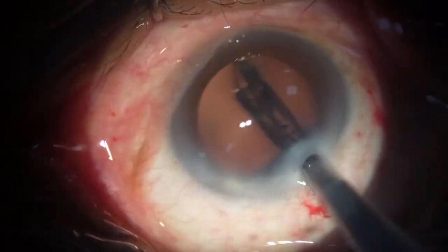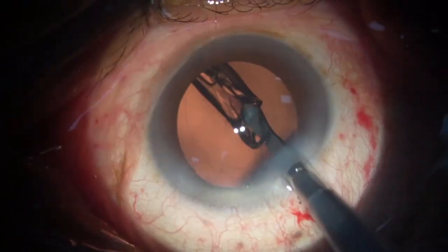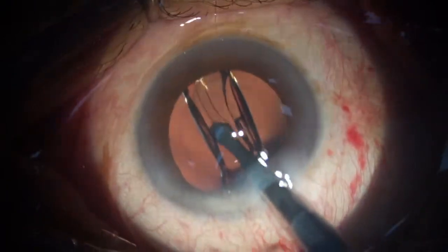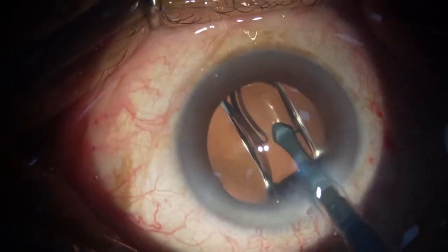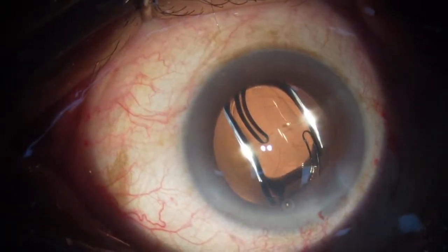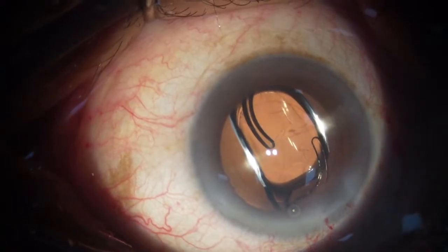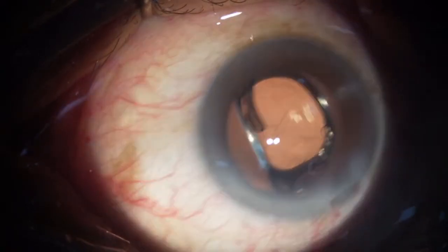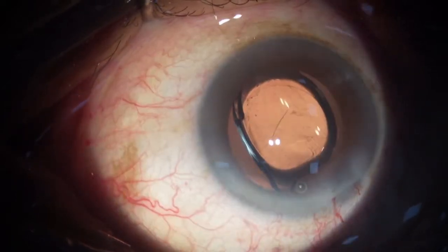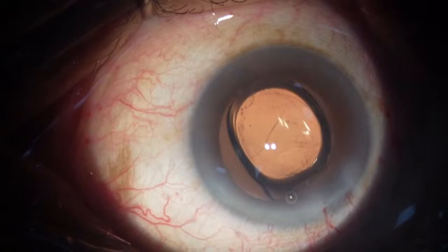So I put the leading haptic into the bag, and I just push the trailing haptic also there, and I will wait for it to unfold. So basically what the lens has is a higher spherical aberration in the center, sorry, the sphericity in the center, so from the periphery to the center, the sphericity increases, and that gives the little extra depth of focus.